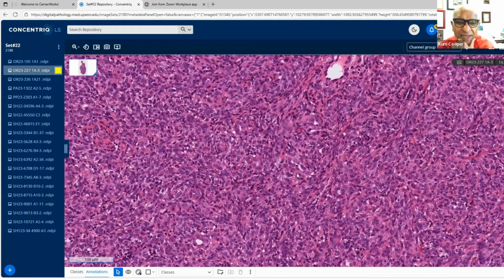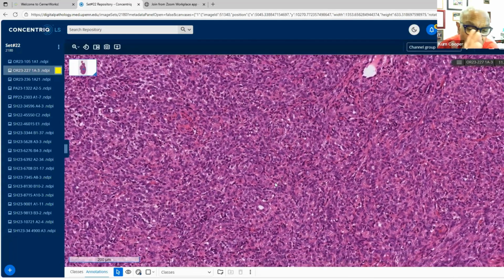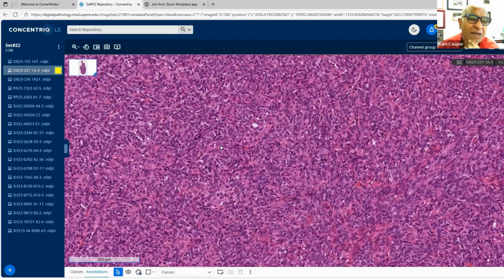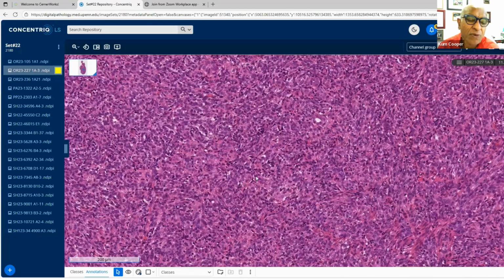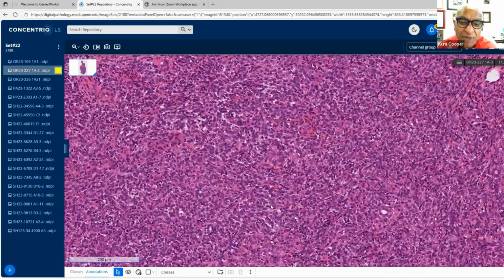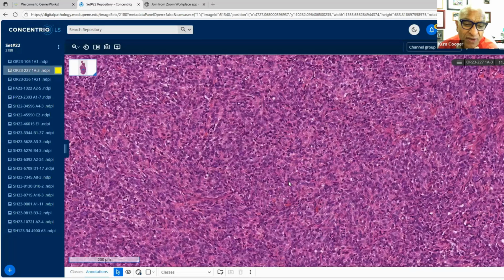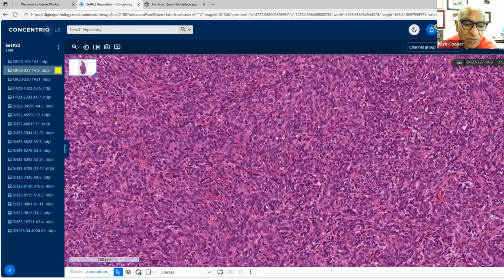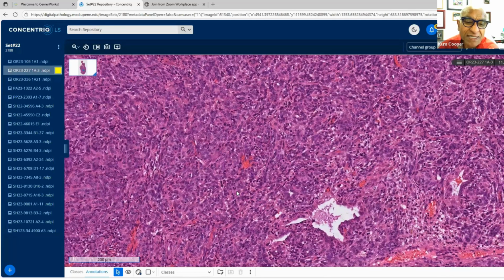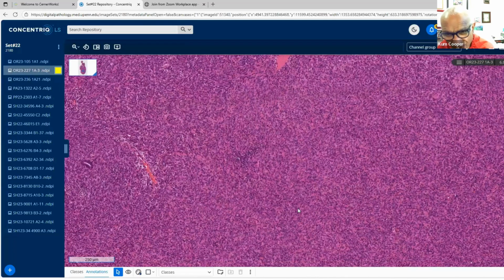You're correct, Florence. This was a nice example of it. I have not resorted to molecular confirmation because seeing the heterogeneity of the morphology as well as the polyimmunophenotypic profile, having the mesenchymal, epithelial, and sex cord stroma markers, I found useful to make that diagnosis. But if you had to resort to molecular analysis, you can. Whilst I'm talking, I'm looking for these spindle areas just to show you that they can be spindled as well. So as you drive around these, you do find a varied morphology.